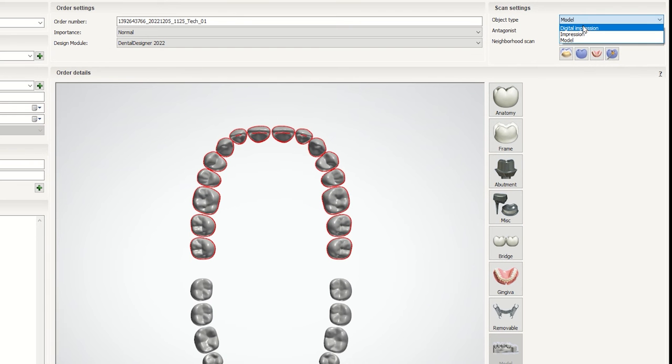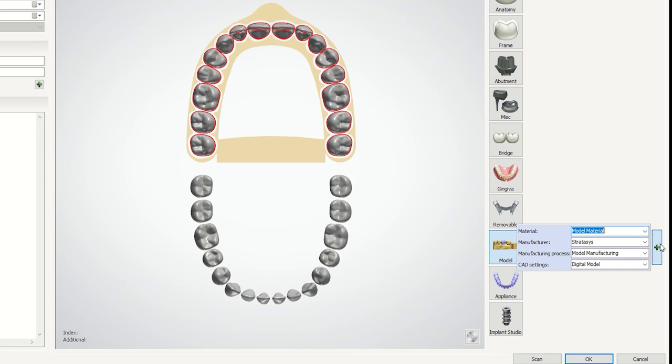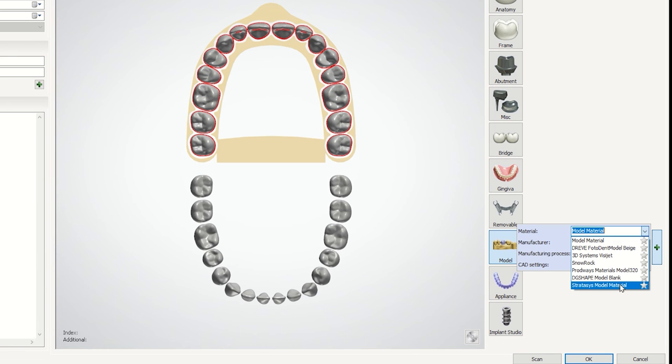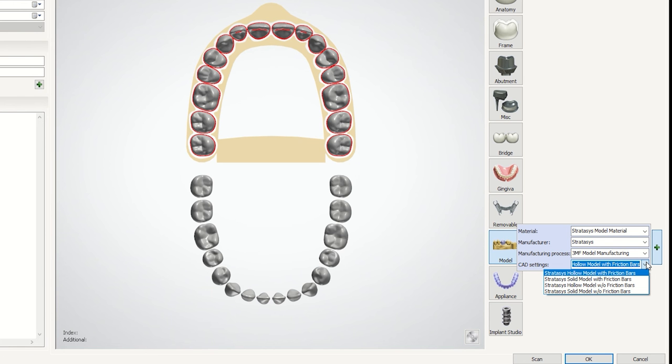Select Digital Impression and under the Model dropdown menu, select as material Stratasys Model Material. The manufacturing process is going to be 3MF Model Manufacturing. Basic models can be either hollow or solid, and you can also choose to use friction bars when using a die. Use your own CAD model if your clinic has one.